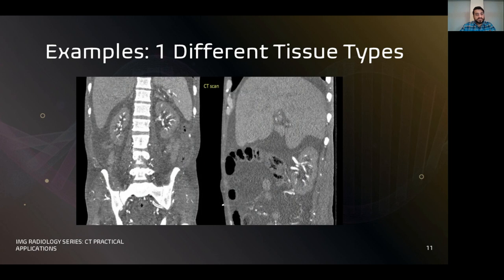So this is essentially bone. This is your lumbar sacral spine. This is your pelvis. And the reason why it's completely white is because this is high attenuation, or hyperdense. In terms of Hounsfield, we said bone was right at the end, which is about plus 1,000. Then we've got some soft tissue here. Most soft tissue will lie anywhere between minus 100 to plus 100. You have air here in the colon, that's going to be at the other end of the spectrum.